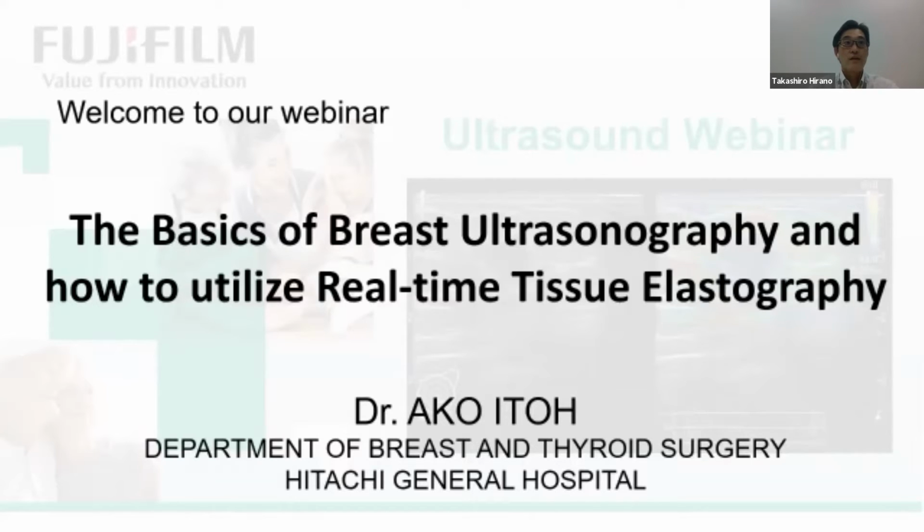Dr. Itoh has a huge experience of breast ultrasound, and she's doing the comprehensive diagnosis based on B-mode, color Doppler, and elastography. She gives you how to interpret acquired information properly and shares her experience through clinical cases.